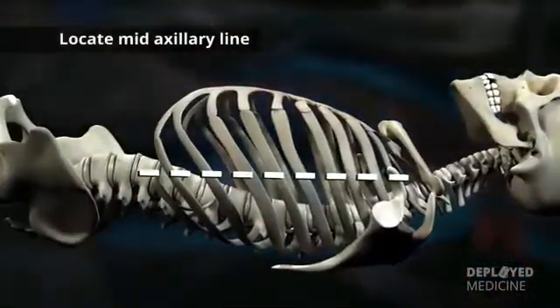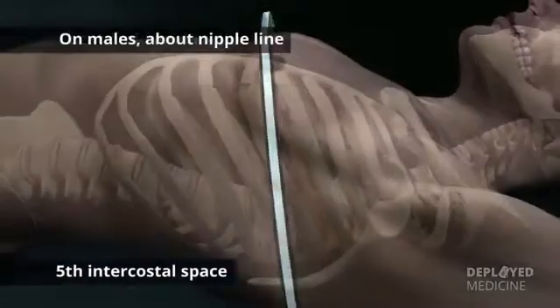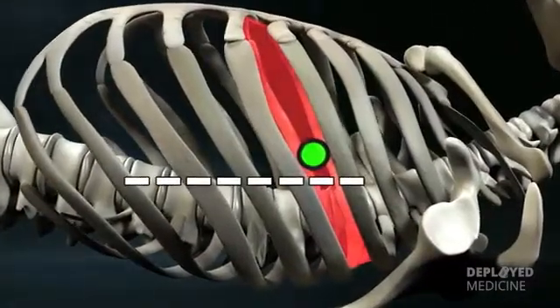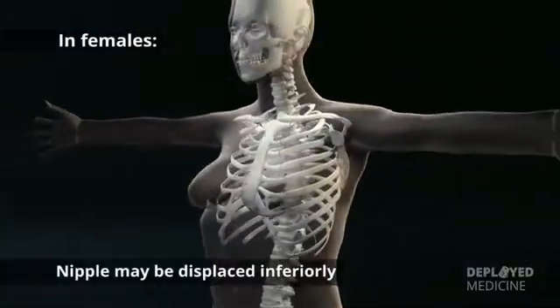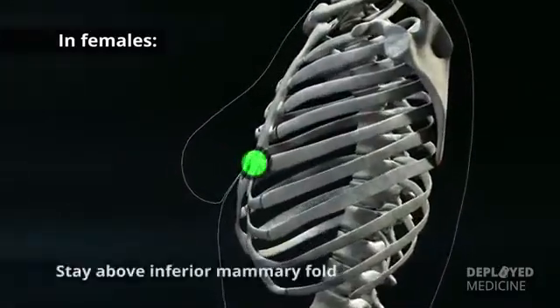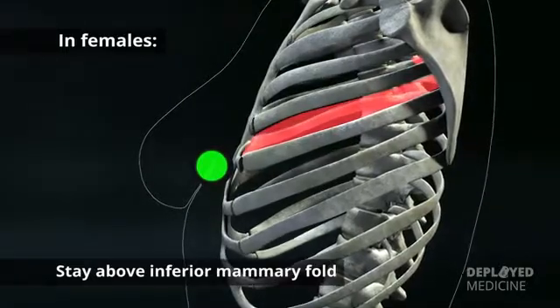We go to the mid-axillary line. We go to the fifth intercostal space, which on males is about the nipple. So you just go just anterior to that fifth intercostal space, mid-axillary line. In females, the nipple may be displaced inferiorly due to the large pendulous breast. So remember to stay above the inferior mammary fold where the nipple would normally lie.